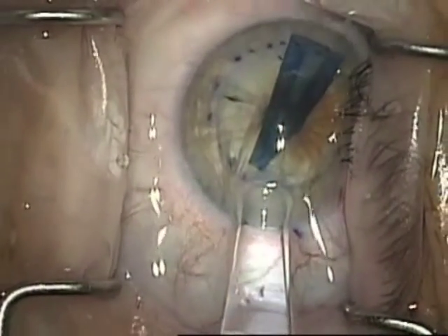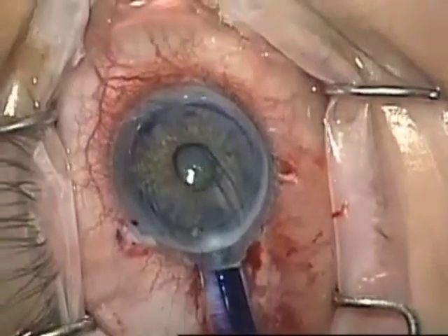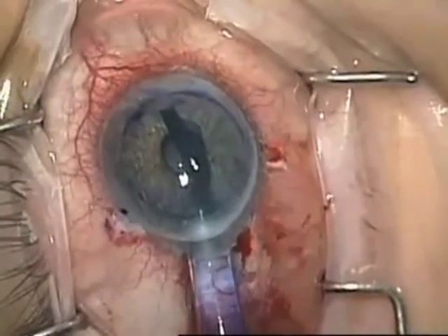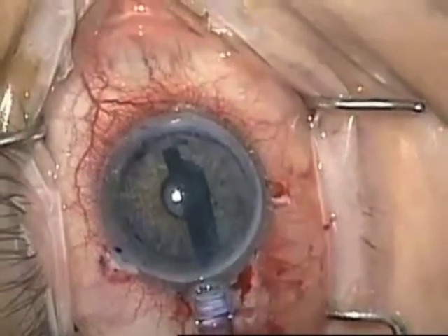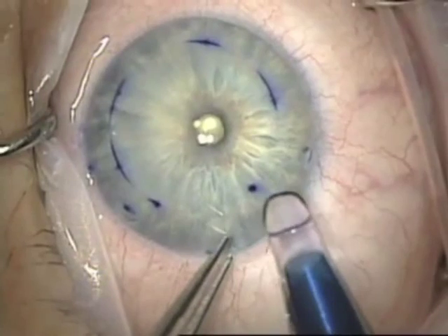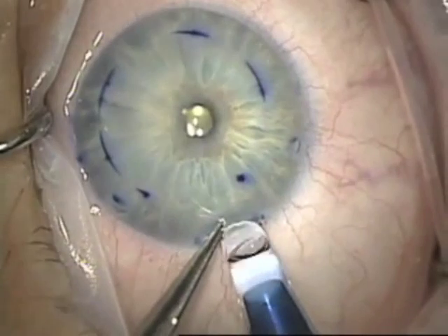It can fit through a 3.2 millimeter incision and is very safe for the graft — it is very smooth glass. You see a couple of examples here of where I'm using this. It can suck the graft right off the punch block and inject it into various eyes. That was one eye that was phakic. You can see it holds the graft very nicely. The phakic eye, incidentally, that was underneath a large-sized PK.